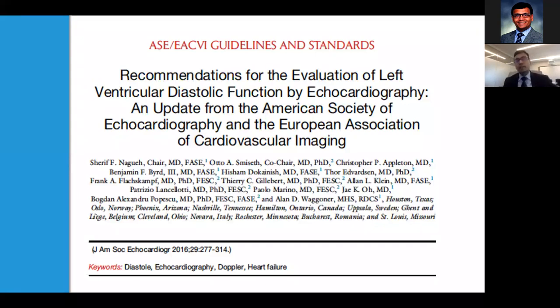In 2016, the American Society of Echocardiography and the EACVI together created a new diastolic function guideline document. The primary goal of the 2016 guidelines was to develop an approach that would simplify and increase the utilization of echocardiographic variables for defining diastolic dysfunction in daily clinical practice, helping towards standardization and a step towards simplification. The document stresses quality and consistency of information, particularly between two or more indices of diastolic dysfunction that have to be relied upon during the interpretation.